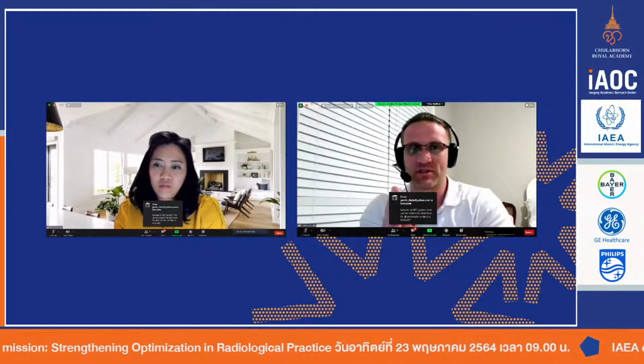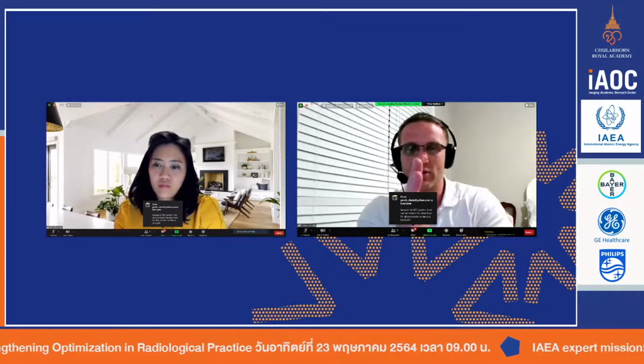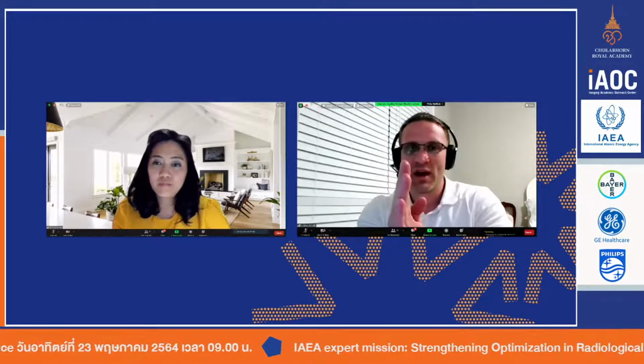And as we talk about in the next talk, all of our dose calculations have to be below a certain value. There's a threshold. And if the system is above that threshold, you cannot use the machine. And so I don't know to what extent Thailand has adopted similar standards. I know the IAEA basically has the same recommendations, so I assume Thailand's probably following the IAEA. And then what you do is you can go in and look at the values, and that 18% will tell you how you can adjust your outputs.